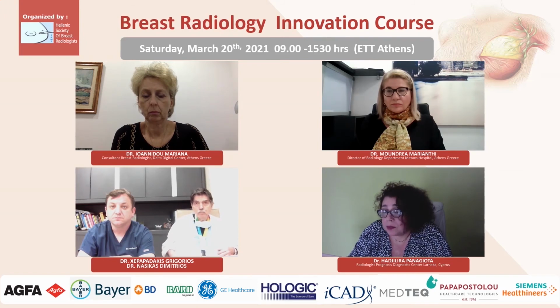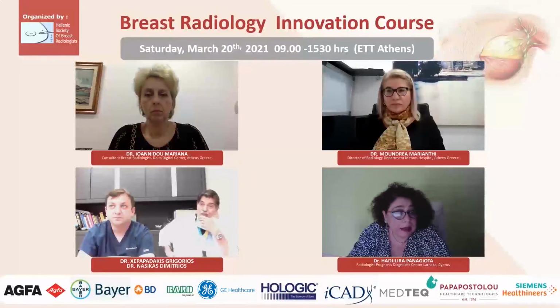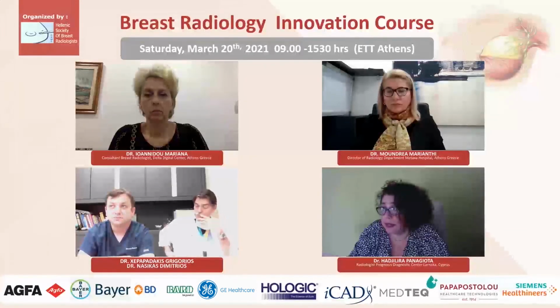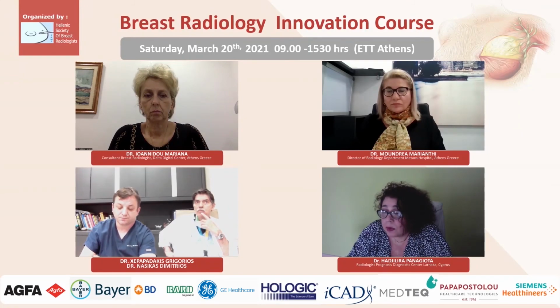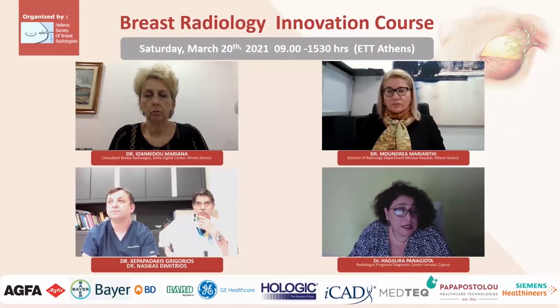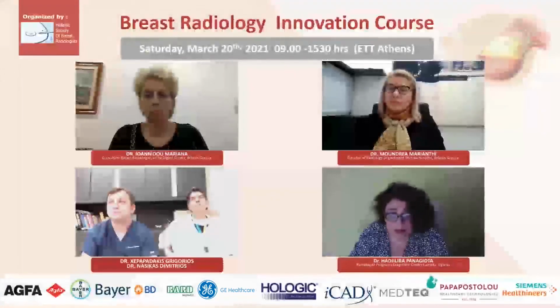We know that DBT depicts more cancers than full-field mammography. Yet in Europe, we have not widely implemented DBT in screening programs. Why? Because DBT raises the cost of equipment, but it also significantly increases the reading time in an era where the shortage of radiologists is an issue or is going to be an issue in most countries in the near future.